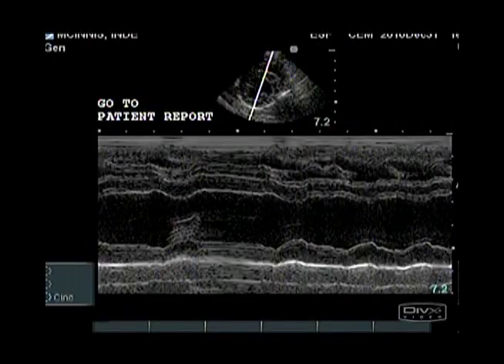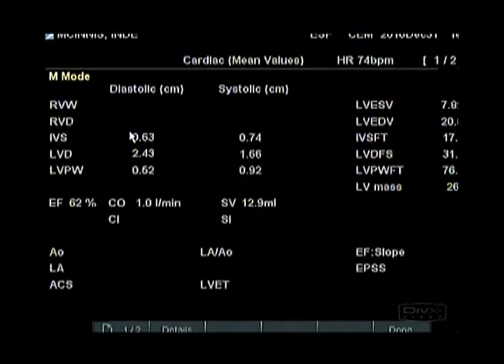The muscle and chamber measurements are temporarily or permanently stored on the patient report of your machine and can be compared to charts of normal measurements for cats and dogs. Consider muscular hypertrophy if a measurement exceeds normal in diastole or relaxation. Excessive measurements in systole may indicate an excessive contraction rather than muscular hypertrophy.